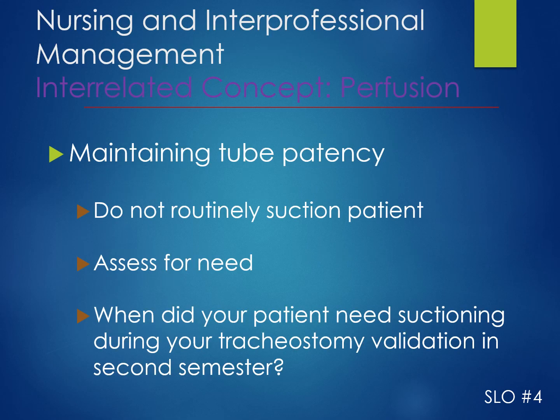We want to make sure that the tube does stay patent, and you guys saw that it's sitting in that trachea, so secretions are going to work their way around the tube and be inside the tube as well. However, this isn't the patient that you want to routinely suction, so there's not going to be orders Q2 hours, Q4 hours. It's only if the patient needs it. So if you start hearing that rhonchi, or if the high pressure alarm, which we'll talk about, is going off on the ventilator, or if your patient just has copious secretions around the mouth, those are going to be indicators that we're going to go ahead and suction this patient.